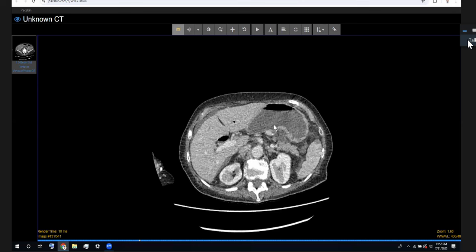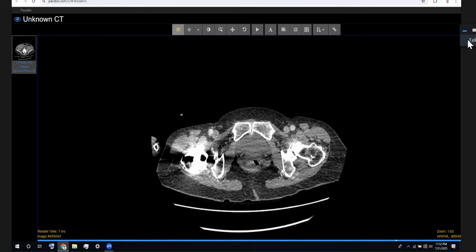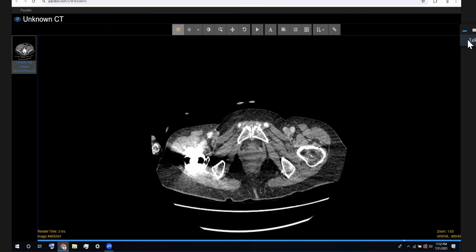And along with anterior wall hernias, I'd include groin hernias in that, like inguinal hernias. So if you're struggling to see what is the cause of small bowel obstruction, I would zone into the groins. And remember in this exam, it's obviously not for this case, but I'm just giving you general tips.